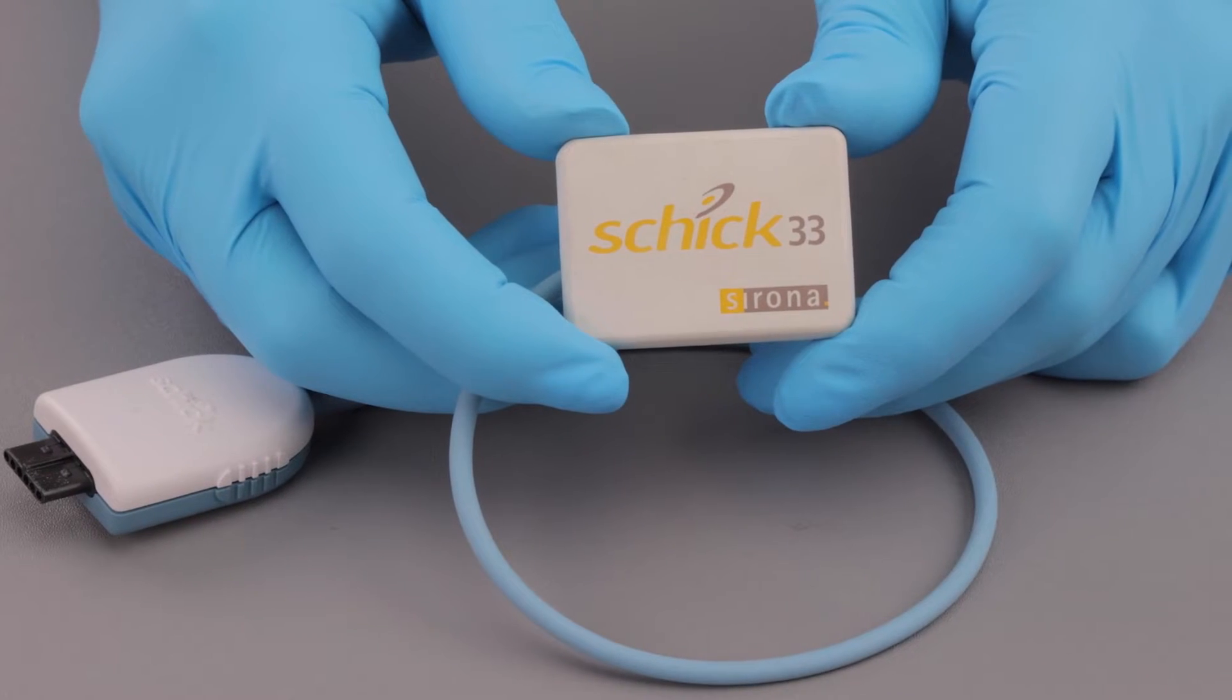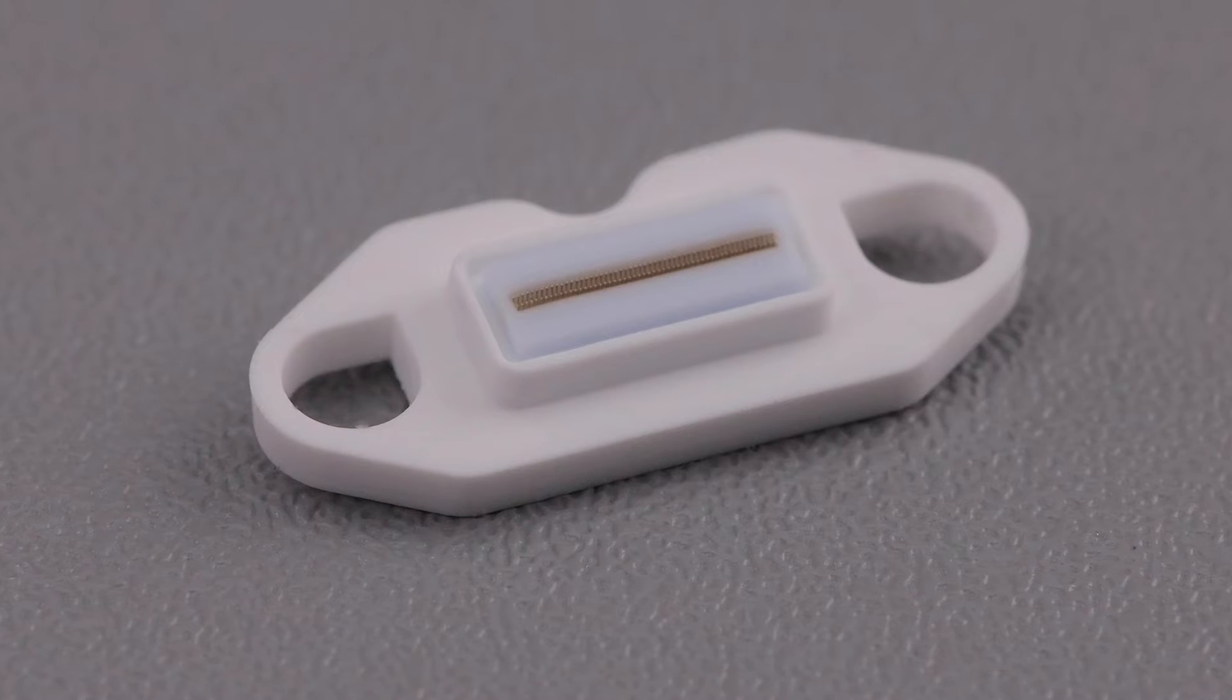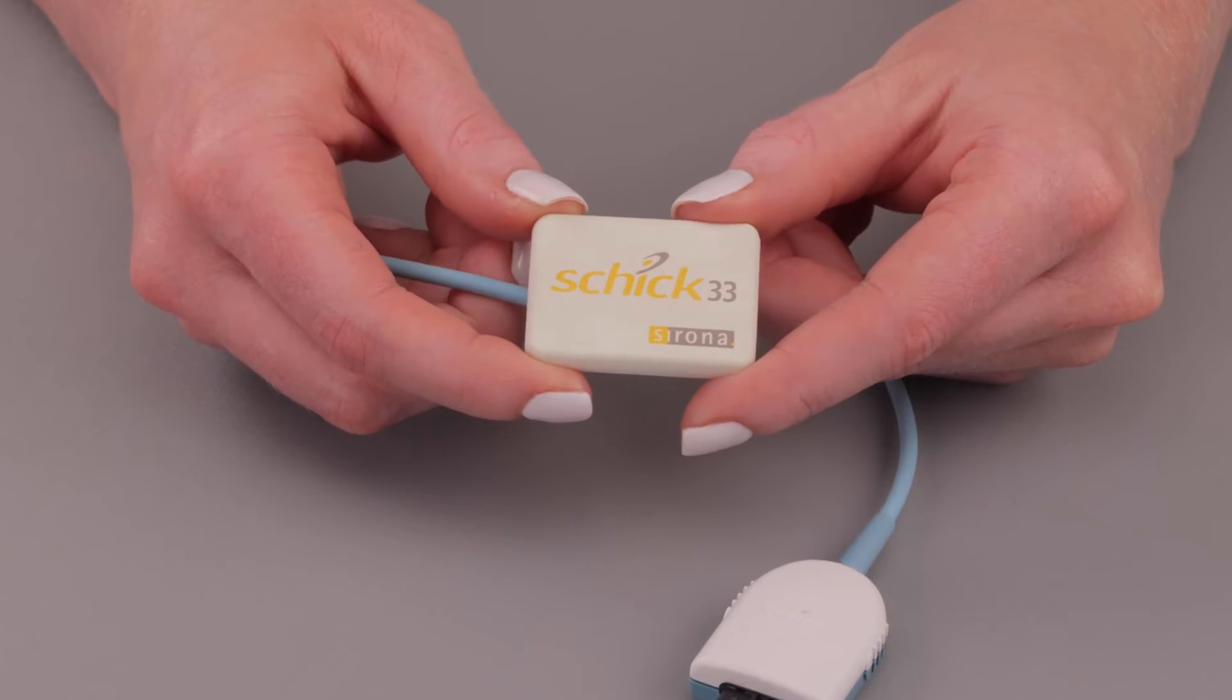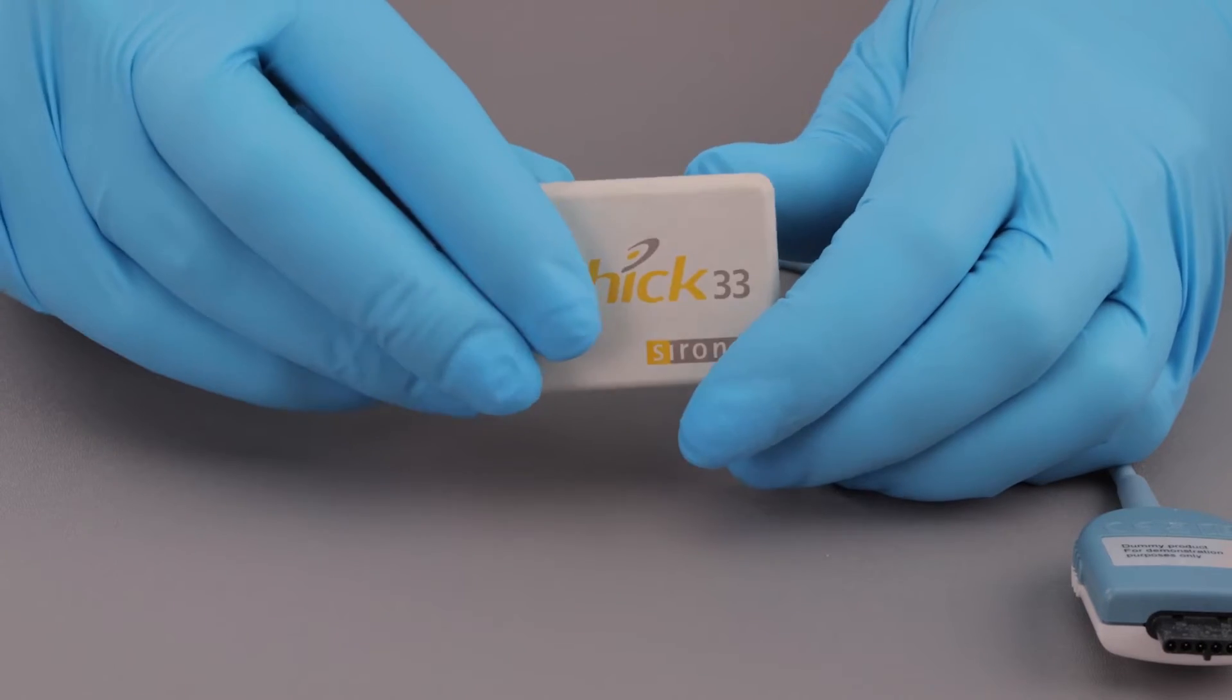First, check the sensor. Schick 33 sensors look similar to this and use white elastomeric strips. Please clean and dry your hands before performing this procedure. If you choose to wear gloves, they must be powder-free.